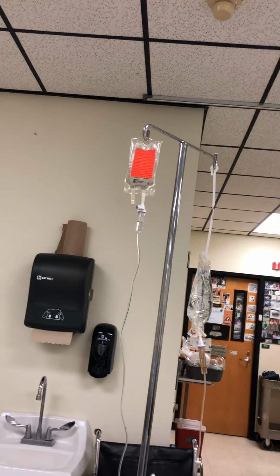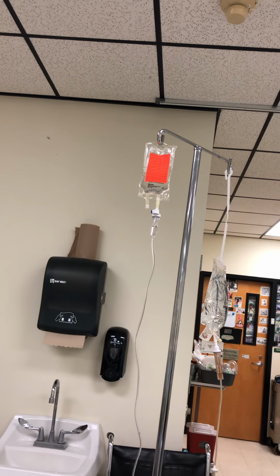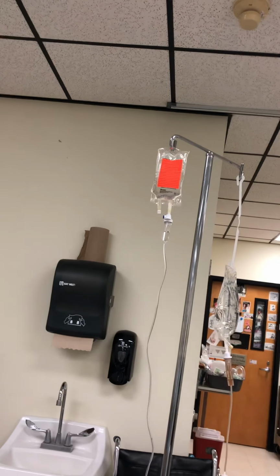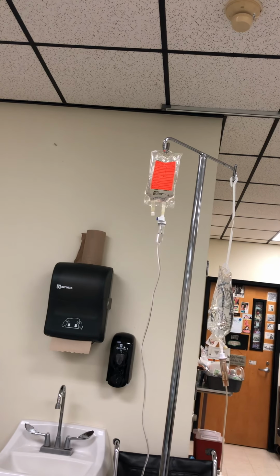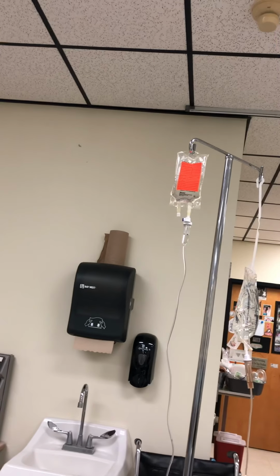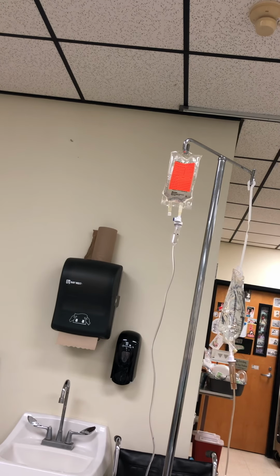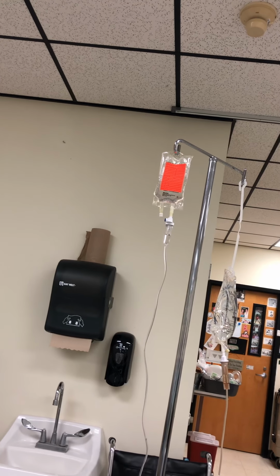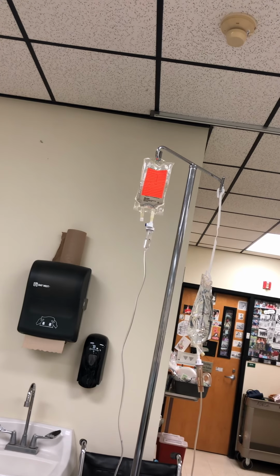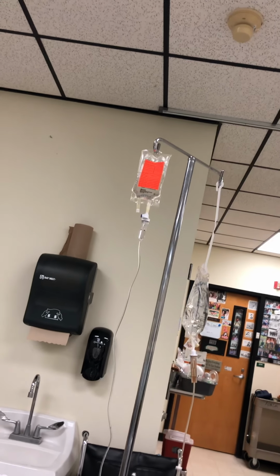Let me wait till I get on the 12. Okay. All right. Those are my 17 drops per minute.